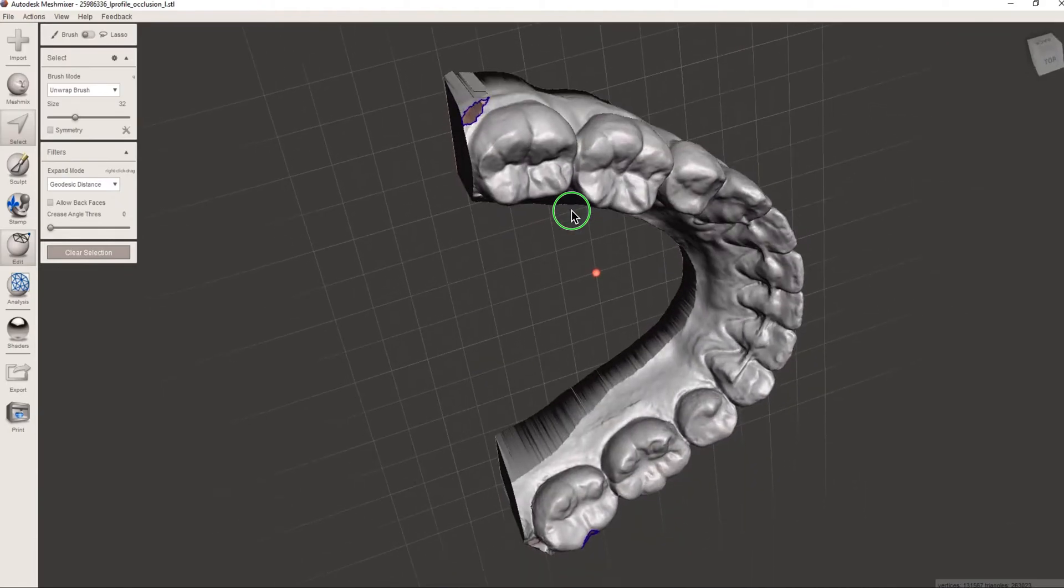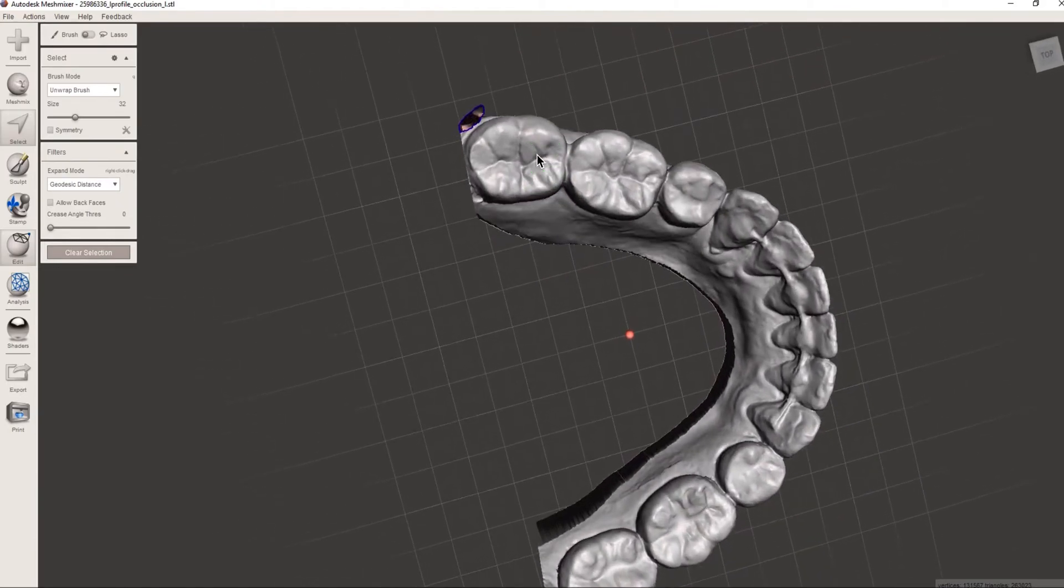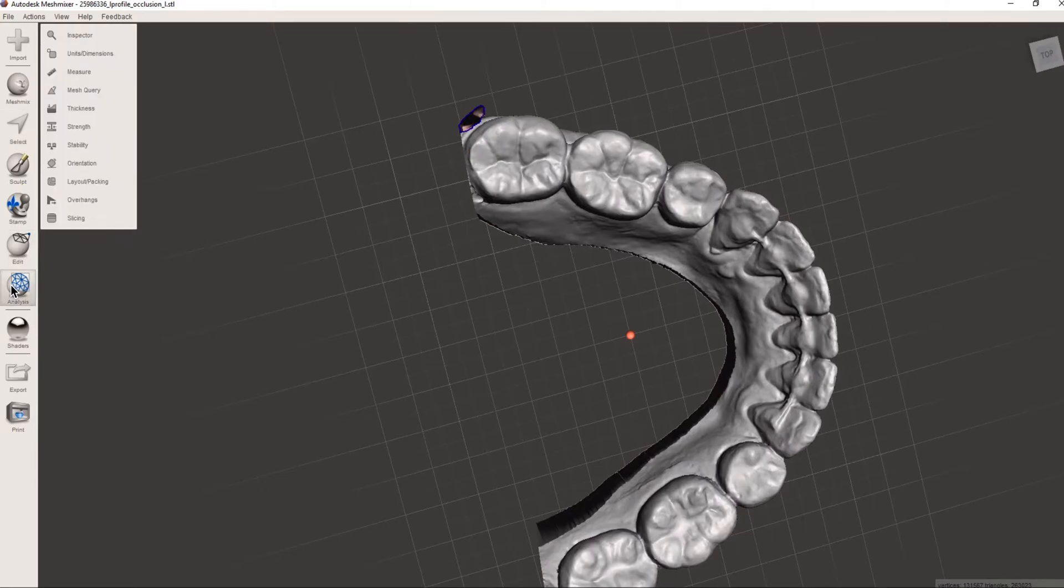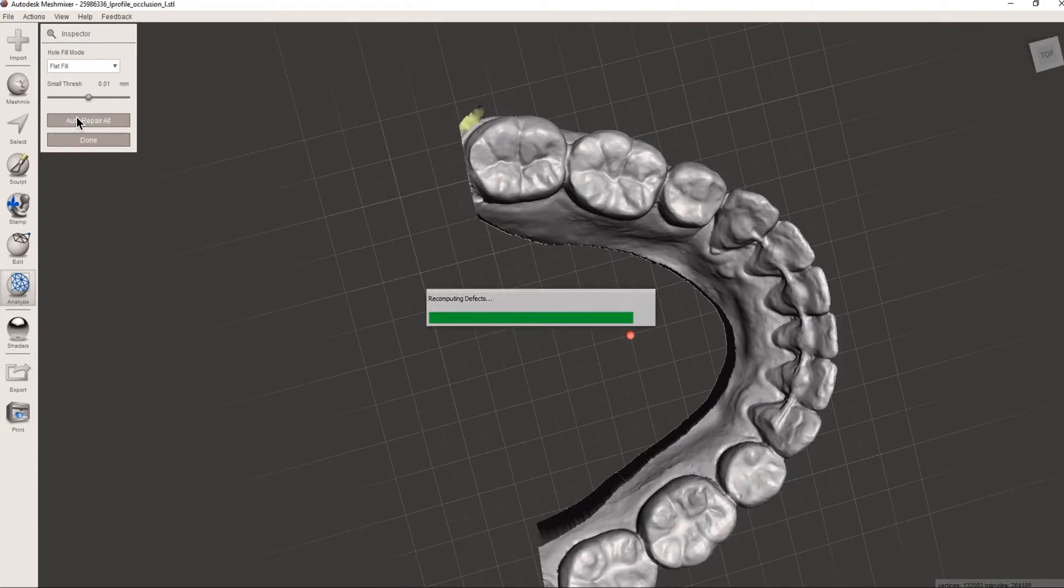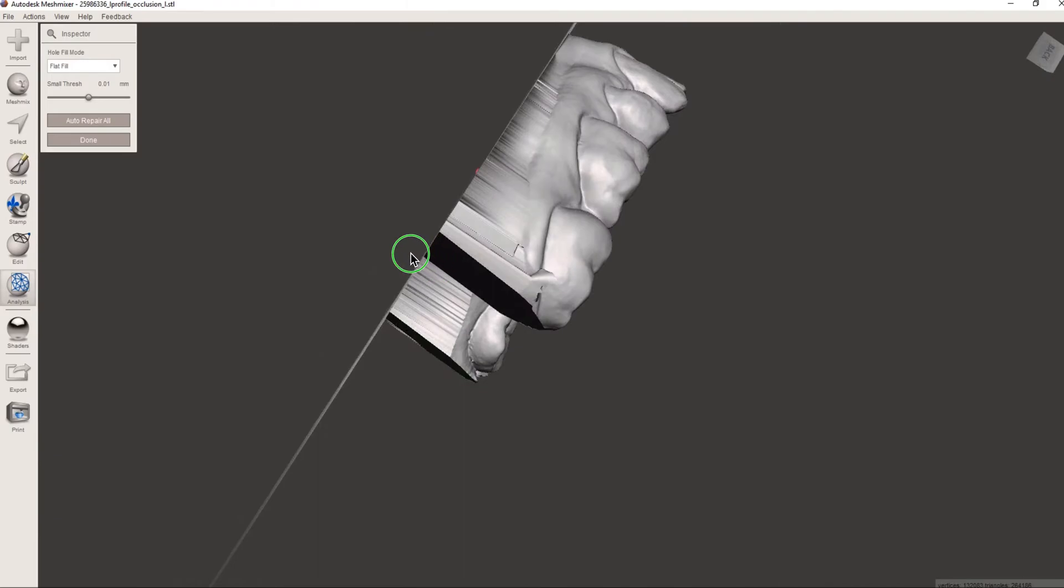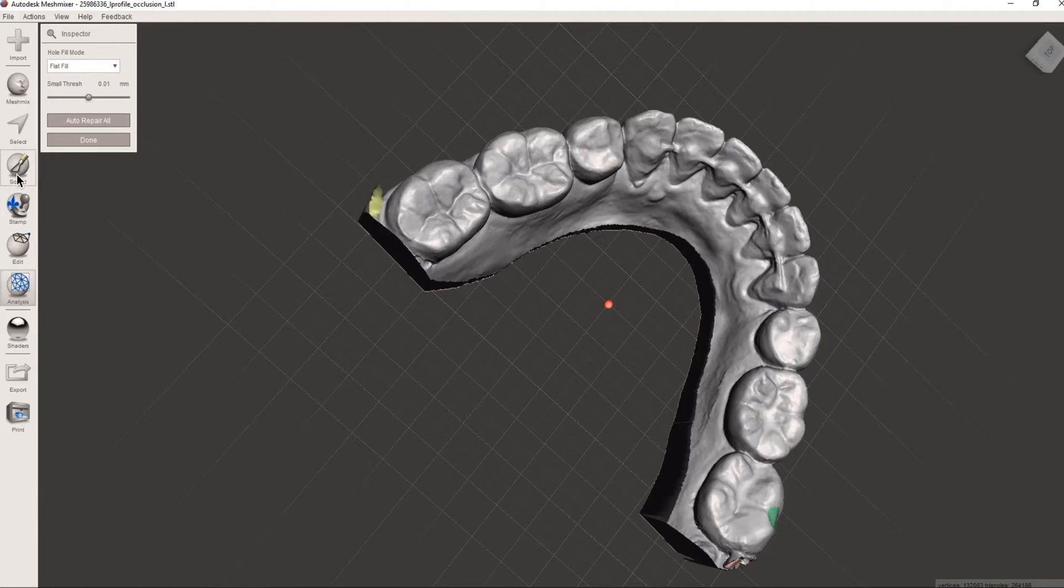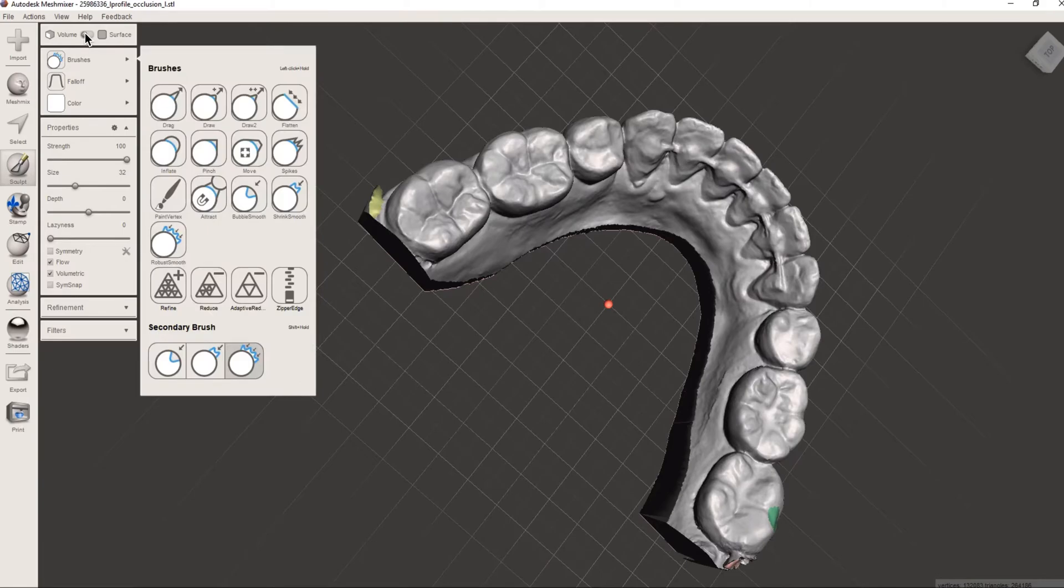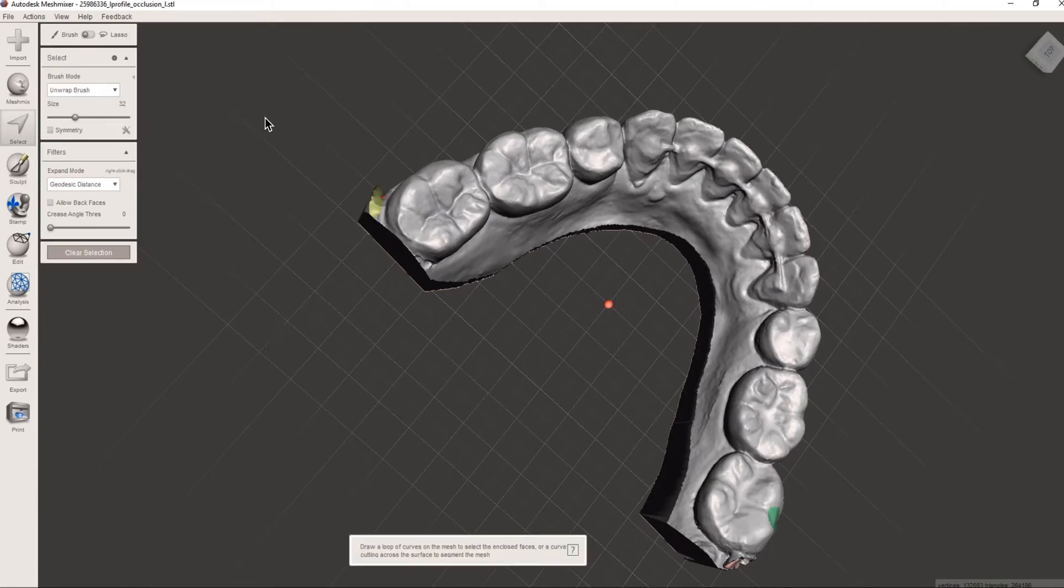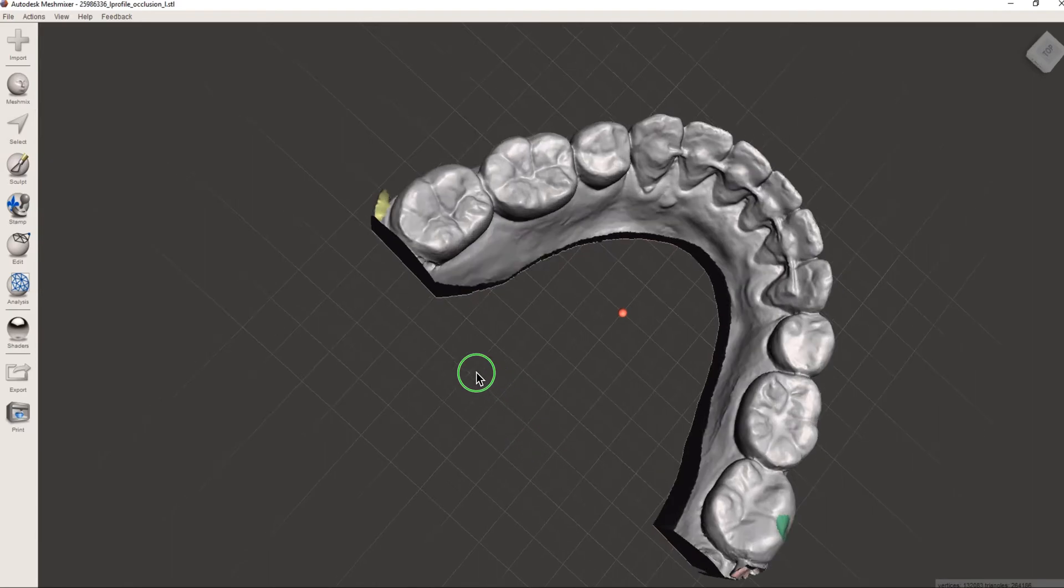Now we have a hole so in order to fix that hole we then go to analysis, inspector, then auto repair and you can see nice and cleaned up. Now the lasso we just make a little circle by holding our left mouse. We can make a little circle around it and it essentially would do the exact same thing. Now I'll just show you real quick. Lasso, we could just circle that if we wanted to. Same exact thing. I'm not going to do it because it's already pretty clean.